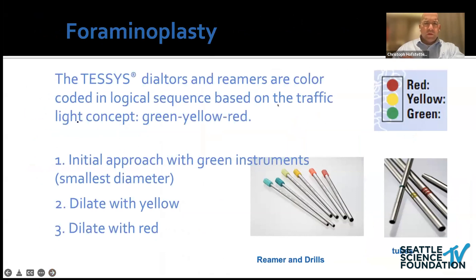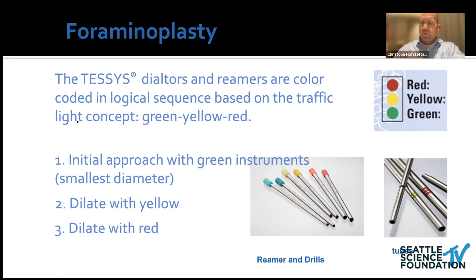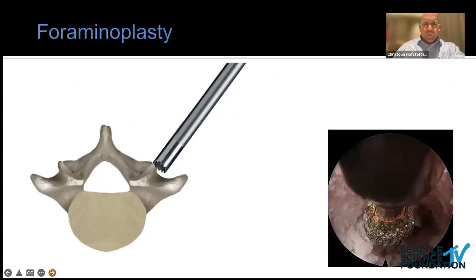Foramenoplasty means opening up the SAP, but it doesn't necessarily mean decompressing the exiting nerve root — and I know everybody's probably shaking their head. The difference is that in a foramenotomy, you also resect the yellow ligaments, scar tissue around the nerve root, and marginal osteophytes. A foramenotomy entails much more than a foramenoplasty — it took me a while to understand that, but it's a really important difference. Here we just do a foramenoplasty using sequential reamers, which are very safe: they have a small overhang of just under a millimeter, so even if you're against the nerve root you won't take it out.